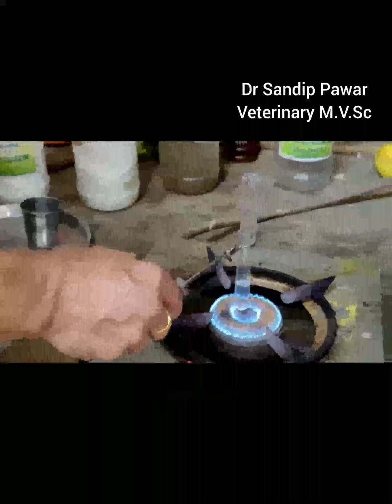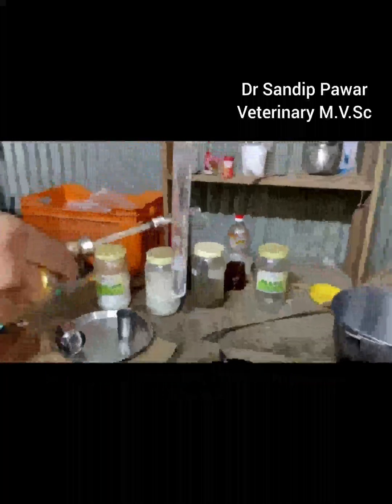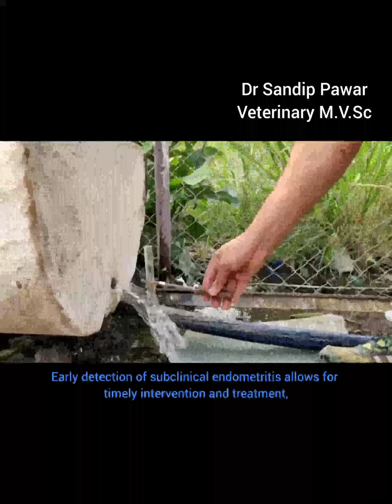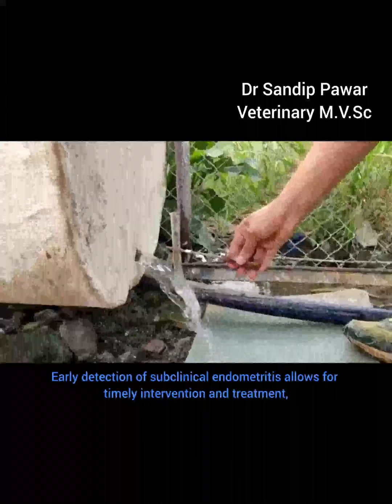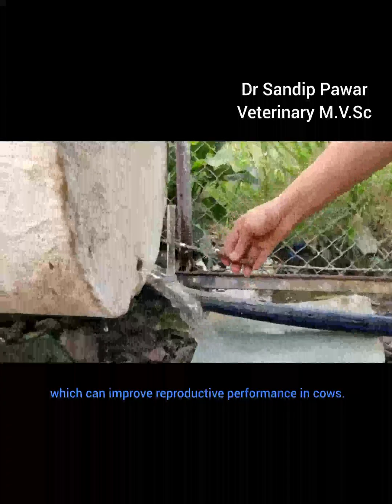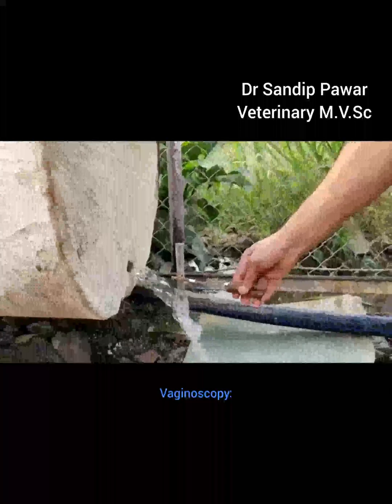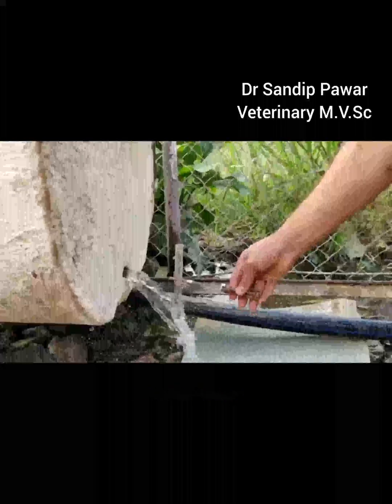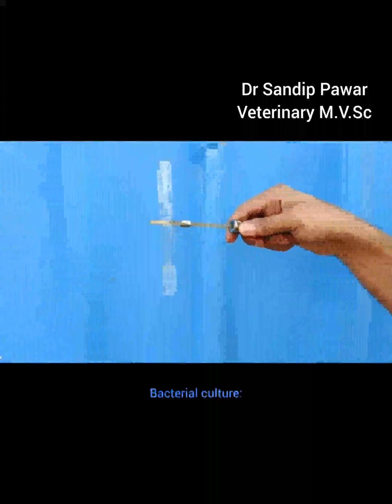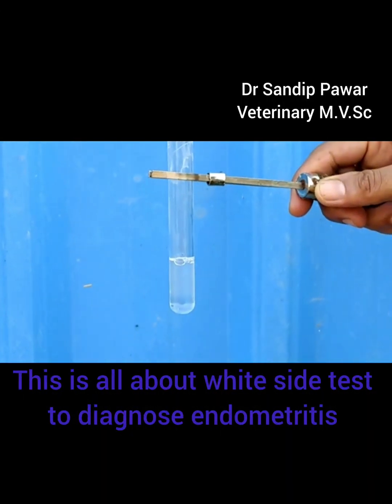Why is it useful? It's a simple and inexpensive test that can be performed in the field, making it accessible for farmers and veterinarians. Early detection of subclinical endometritis allows for timely intervention and treatment, which can improve reproductive performance in cows. Other diagnostic methods include vaginoscopy, uterine cytology, transrectal ultrasonography, endometrial biopsy, and bacterial culture. This is all about the white side test to diagnose endometritis.